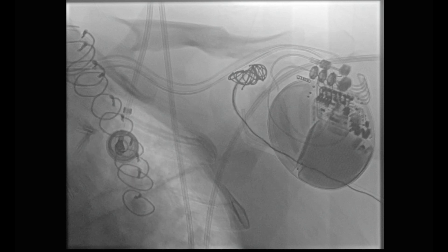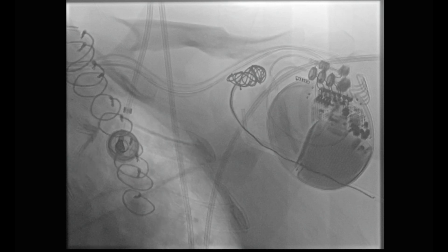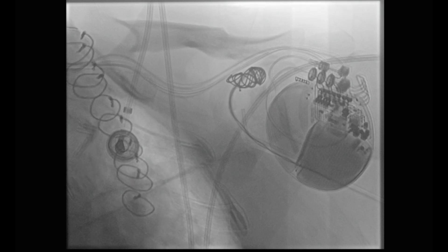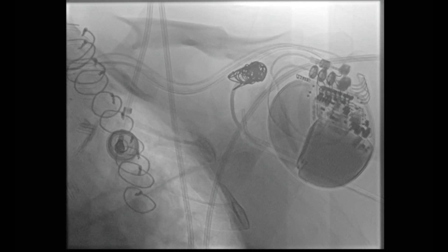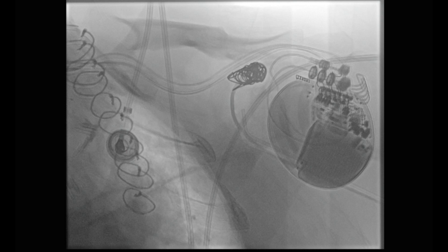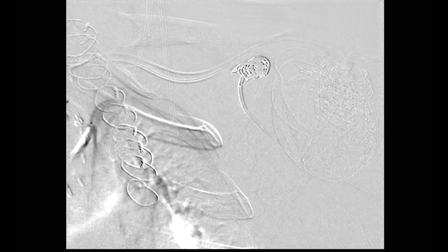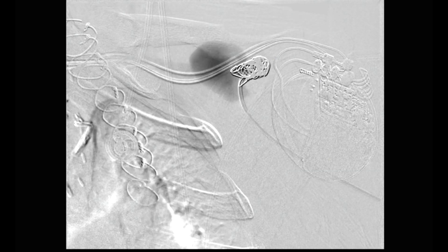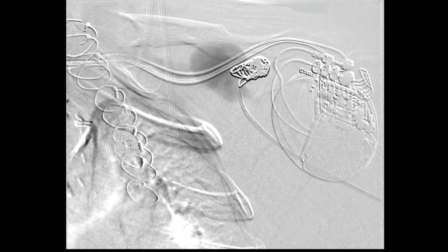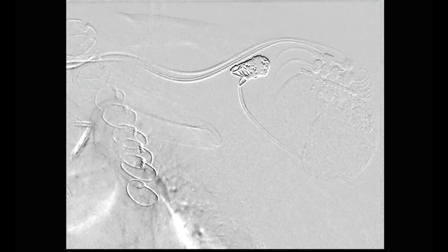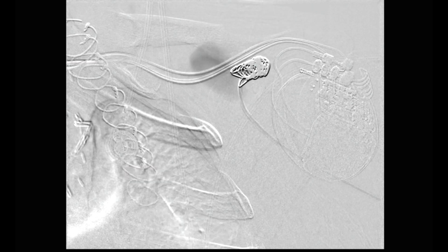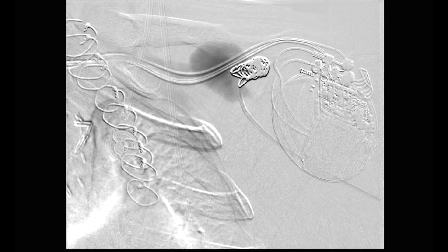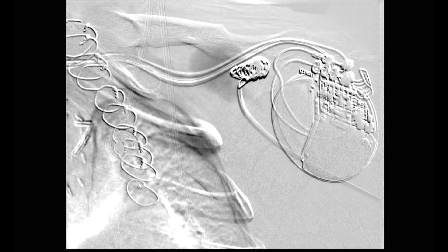A second coil was deployed and angiography was performed in order to see if any additional coils were required. In the angiogram, arterial filling of the fistula was seen, so the decision was made to continue the intervention.